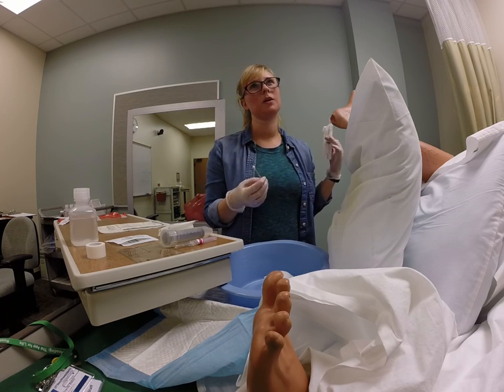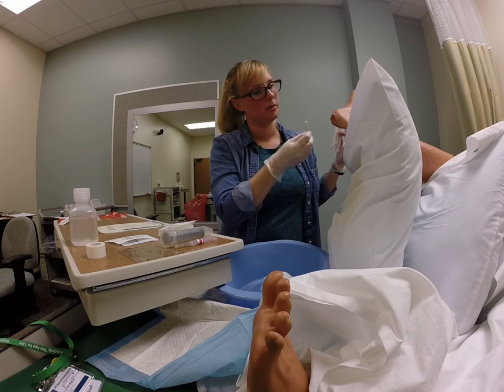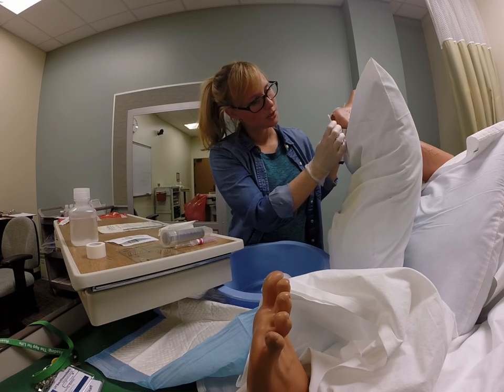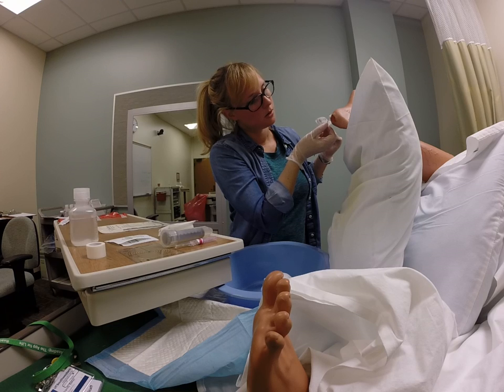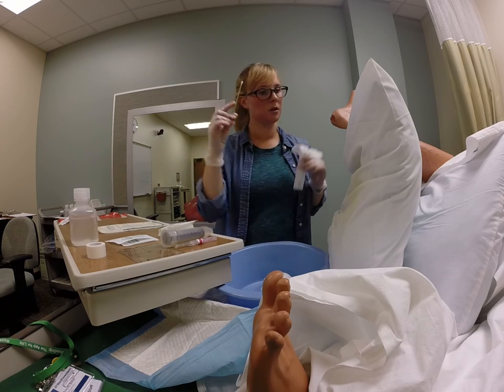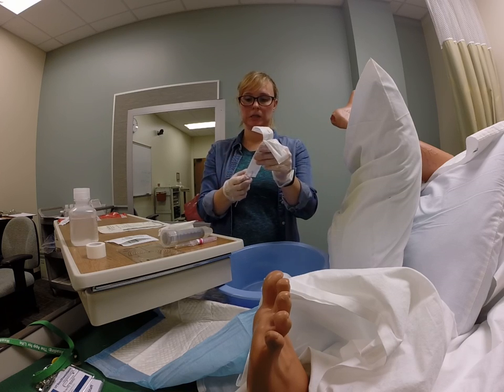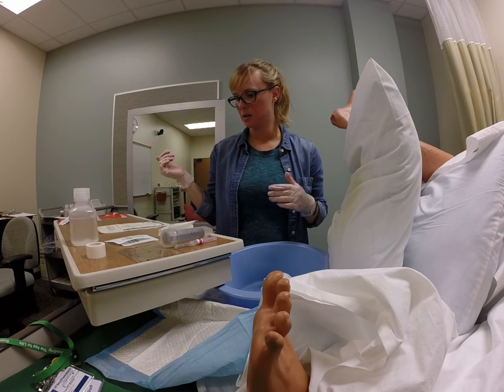Alright, so this one, you can't really cross over your wound because you're parallel to your wound. You're not over it. So you can do width. Usually you do length first. So the length is going to be from head to toe, so top to bottom. And don't touch the wound, just hover over it. 3. Dispose of that one. Use my new one for any tunneling. And my depth. It's tiny, like half. So 3 by 2.5. Okay. So that's that.